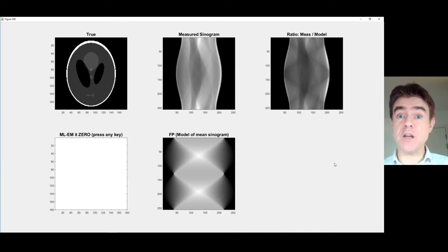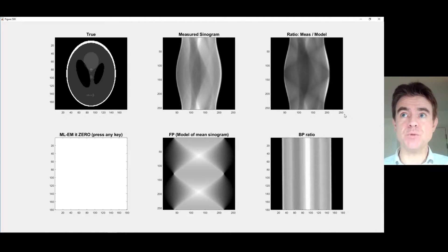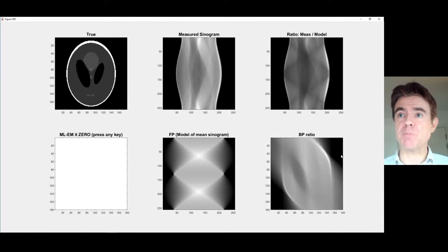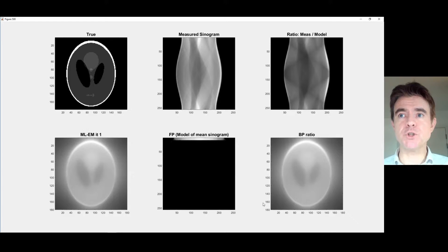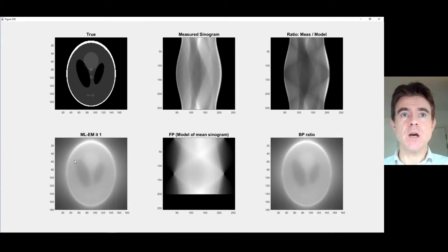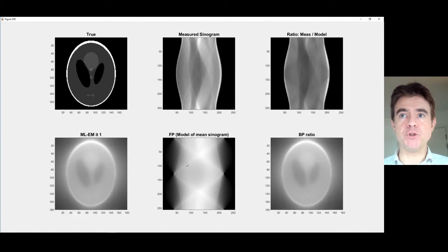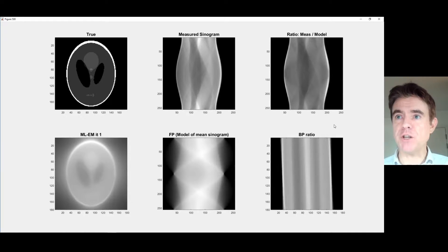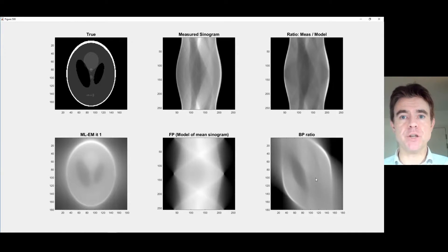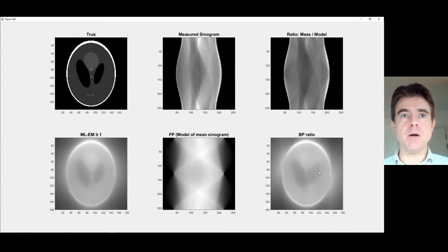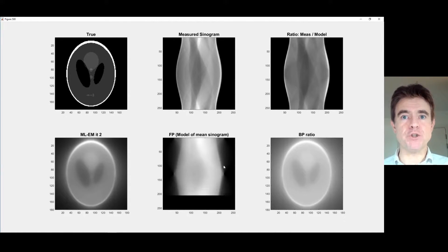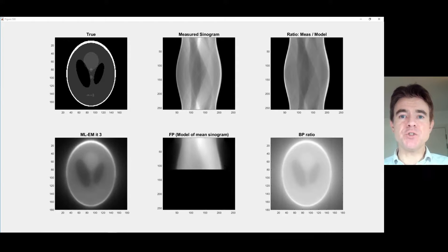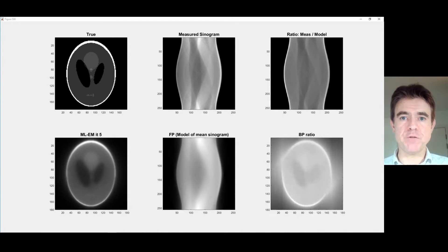What we're going to do next is back project that ratio, divide by the sensitivity image, and then multiply — and that's all there is to it. There's the back projection of that ratio, which we then multiply. Then we forward project it again, take the ratio again, back project that ratio once again and multiply, ready to forward project again. So this is a very, very simple iterative method.